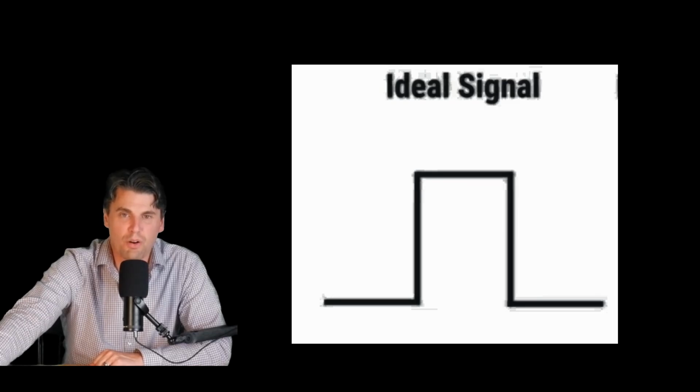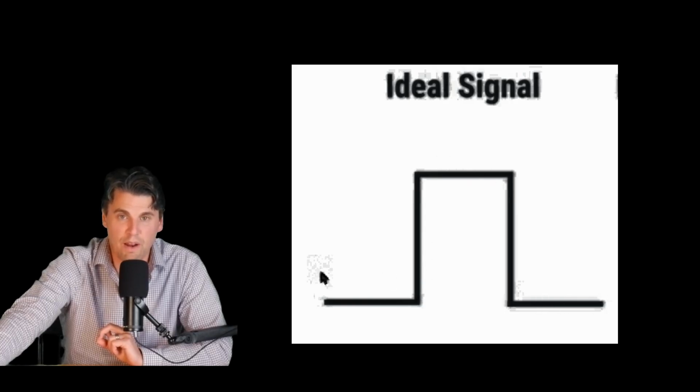Next, I'm just going to show a few plots here. If we drew a plot down the middle of those squares in the images that I was just showing you, the plot would look like this. If it was a nice ideal image, it'd be this nice, what we call a rectangular function, representing that little square that we had.